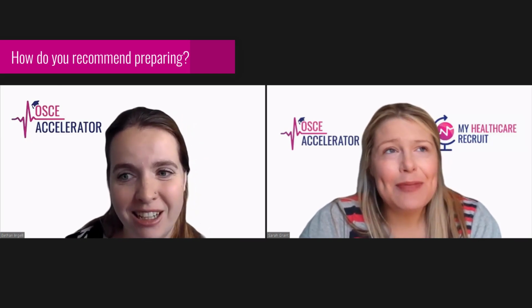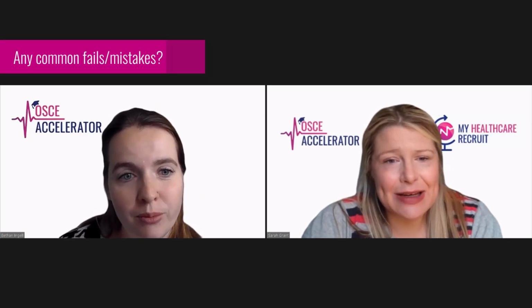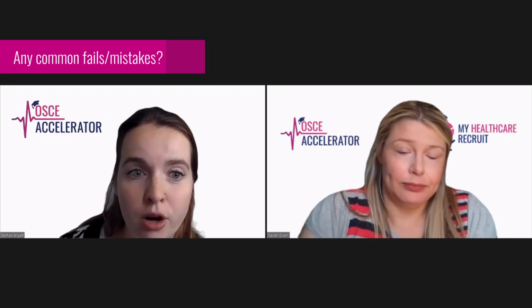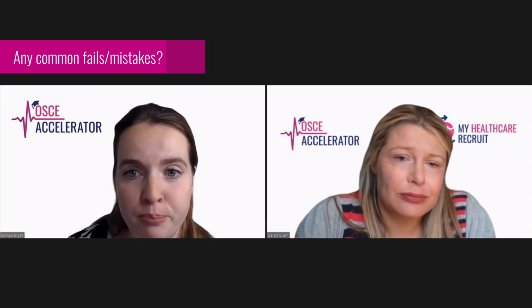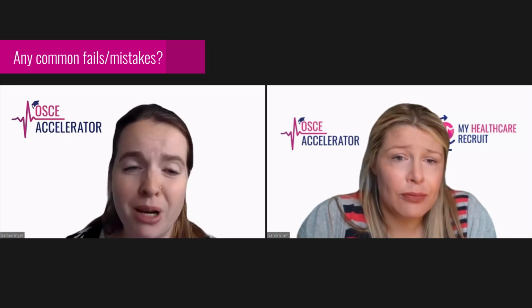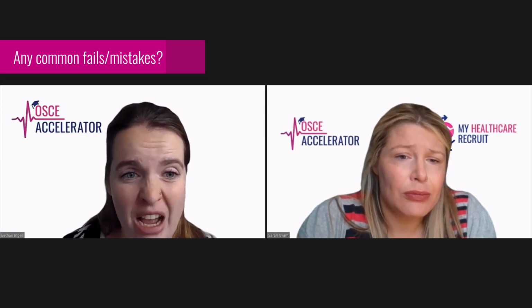Are there any common mistakes that candidates can focus on avoiding? I went to a conference for OSCE educators a few years ago, and they said one of the common mistakes was not removing all the water from the balloon. Sometimes we can remove it and there's still water in there, and obviously it's not a real patient, so they're not going to tell us it hurts.